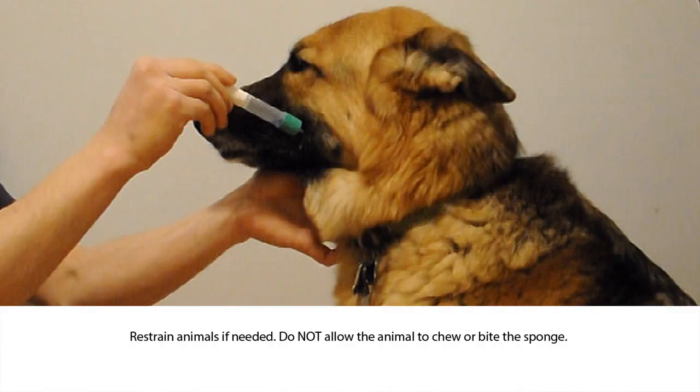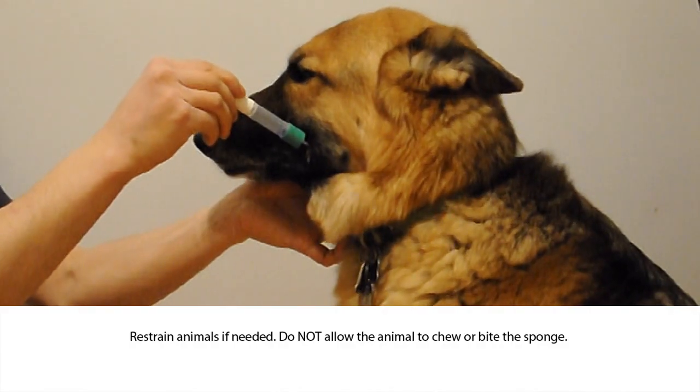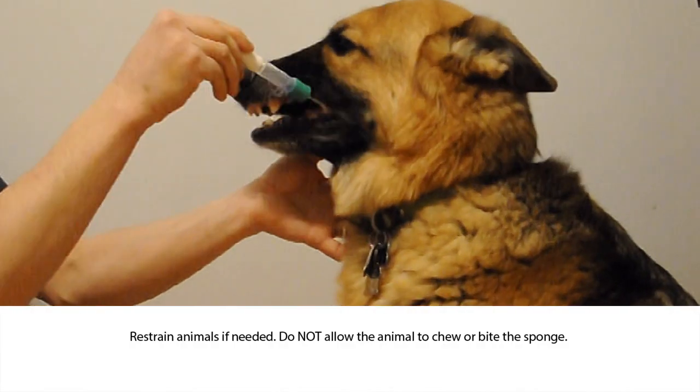For animals older than 6 months, moderate restraint may be required. Do not allow the animal to chew or bite the sponge.